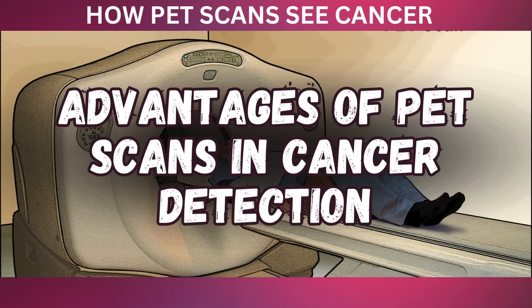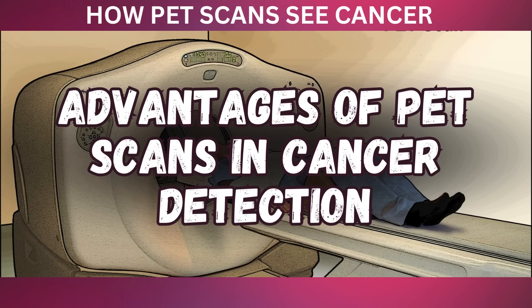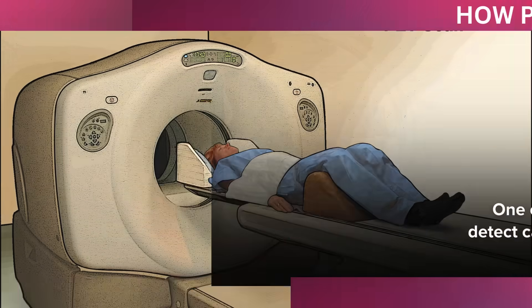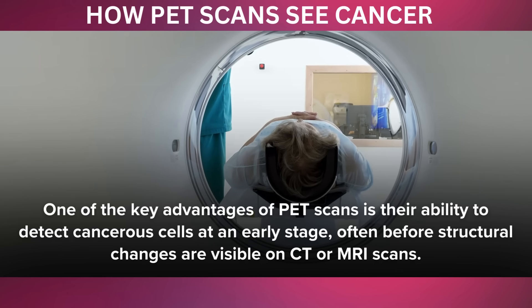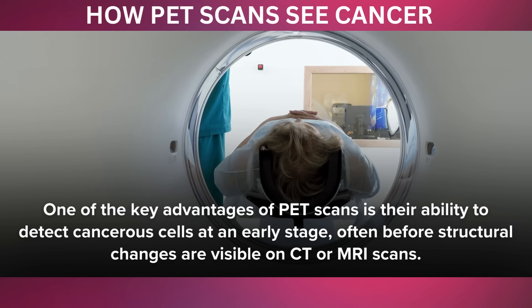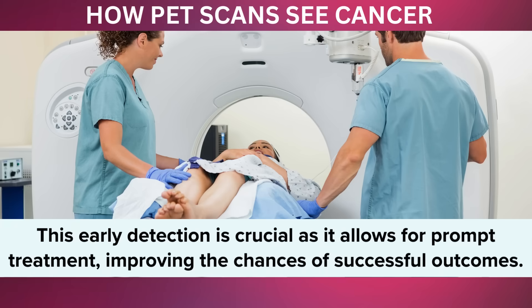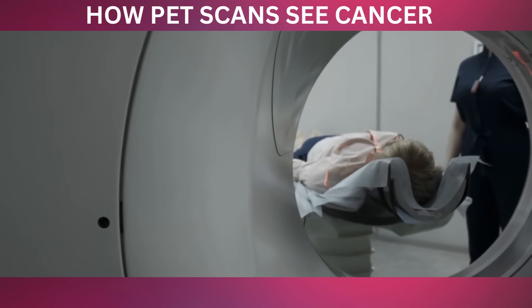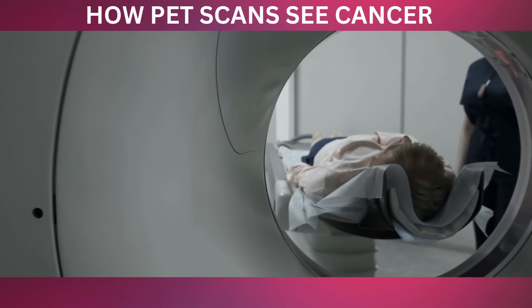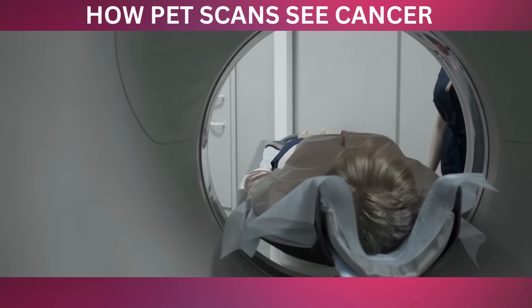Now that we've covered how a PET scan works and what the experience is like, let's explore the benefits of this powerful imaging technique. One of the key advantages of PET scans is their ability to detect cancerous cells at an early stage, often before structural changes are visible on CT or MRI scans. This early detection is crucial as it allows for prompt treatment, improving the chances of successful outcomes. PET scans are also highly accurate in staging cancer, providing detailed information on the extent and spread of the disease, which is essential for developing an effective treatment plan.